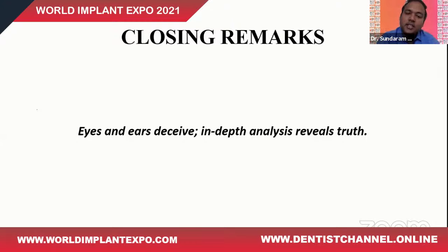Nevertheless, there is a duty of care that all clinicians bear to ensure that each potential implant patient has properly been evaluated so that each implant can be safely placed with the greatest chance of success. Due to an overall reduction in radiation dose, increased availability, facility of simulation, and an understanding of the risks of implant placement, it is becoming only more difficult to justify not using 3D imaging as a part of peri-implant planning.